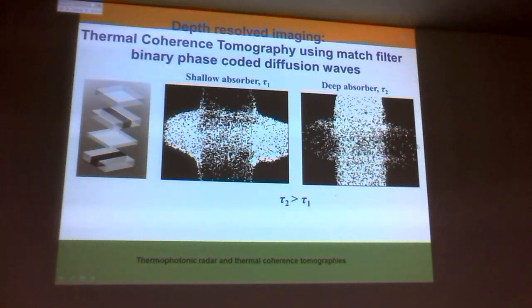Because it just goes in and sets the 0 time, and by setting the 0 time, you're actually looking at where the peak of the response is going to be, and that response is narrow enough so it allows you to decouple layers one on top of the other. So now I can do imaging at different depths, and this is what optical coherence tomography does. It is a tomography in the depth sense, not in the scanning sense, that you start seeing different layers, different planes below the surface. So this is what I'm really targeting this for.